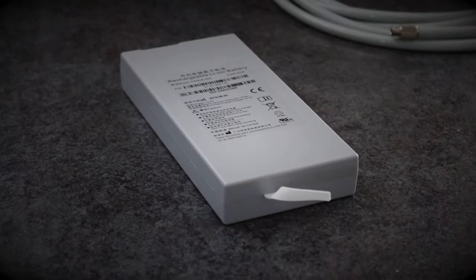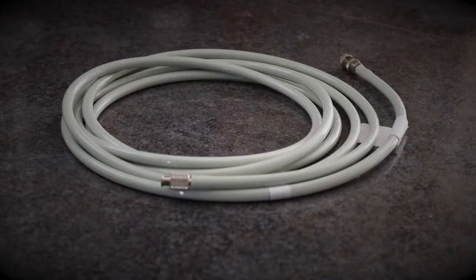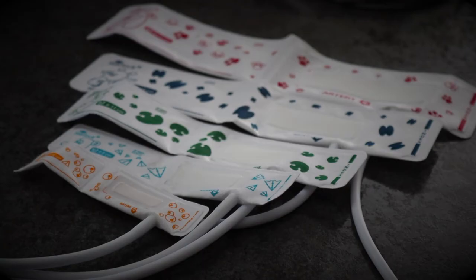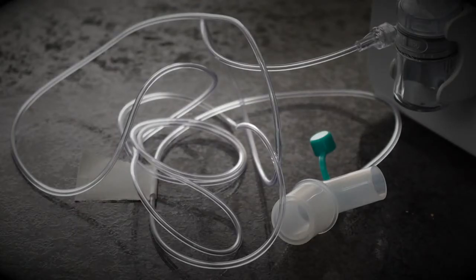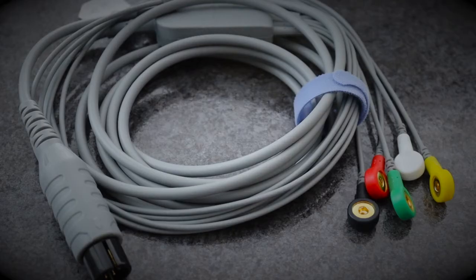We have the pulse oximetry lead, the battery, the blood pressure lead, the blood pressure cuffs, the temperature probes, the water trap and sampling line, and the ECG leads.